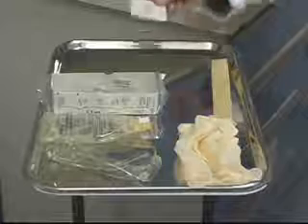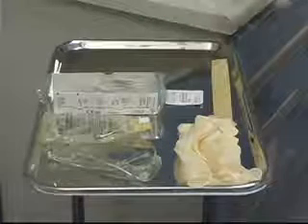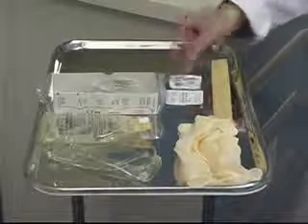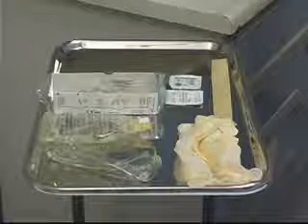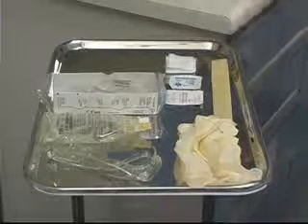We'll use a tourniquet to wrap around the arm to help us determine which vein will be best to use. Once we've done that, we need to clean the area, and in order to do that, we're going to use first povidone iodine. And once that's dried, we'll clean that off using a plain alcohol swab. We're going to have a small piece of 2x2 gauze to help clean up any messes that we might make.